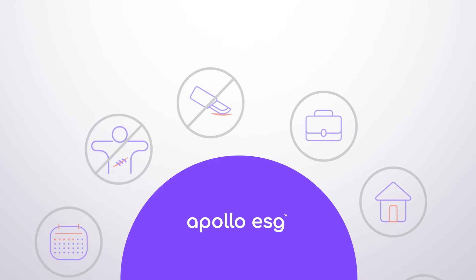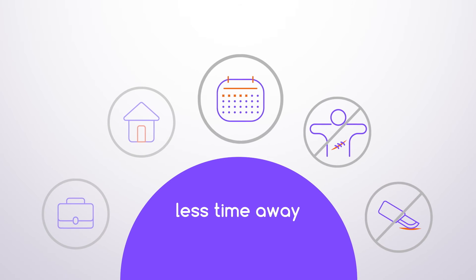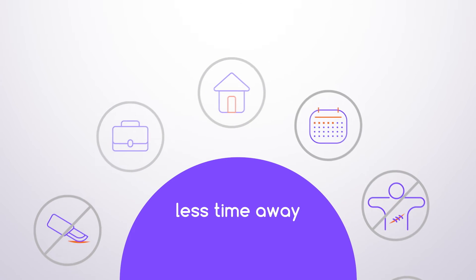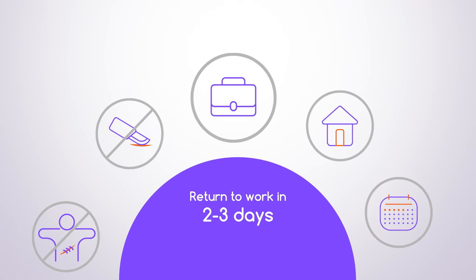This advanced endoscopic procedure does not require incisions, meaning no scarring and less time away. Most patients typically go home the same day as the procedure and can return to work in two to three days.